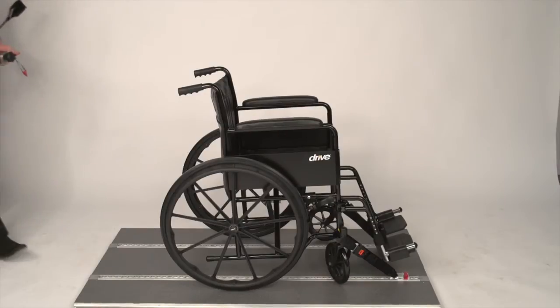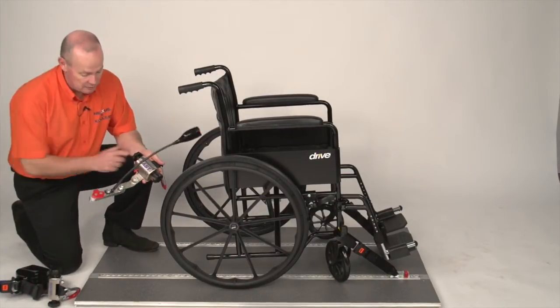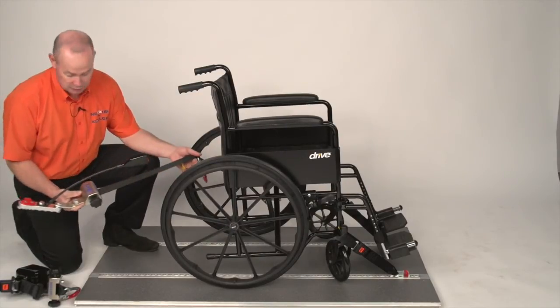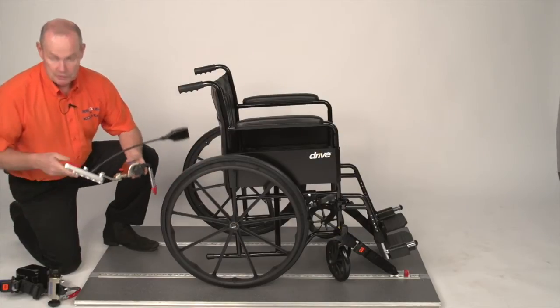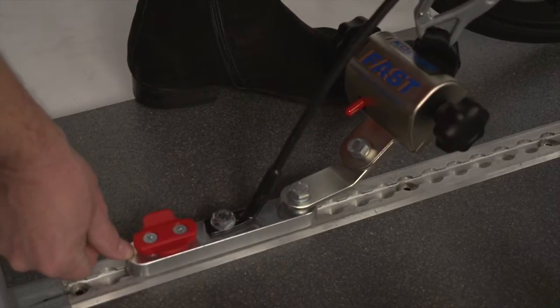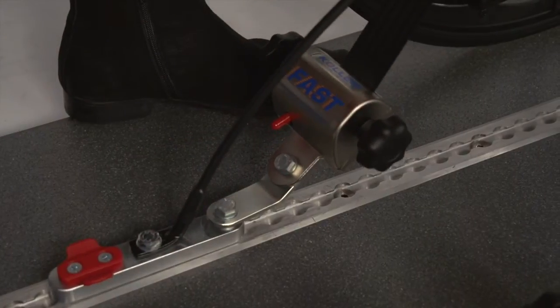We're now going to secure the rear of the wheelchair. The way the FAST system works is you press the red lever down — that will release the webbing. As soon as you let the red lever go, it will retract. Start off by putting the same clip as we've used before into the track, hearing it click, and attaching onto the wheelchair at a 45-degree angle.